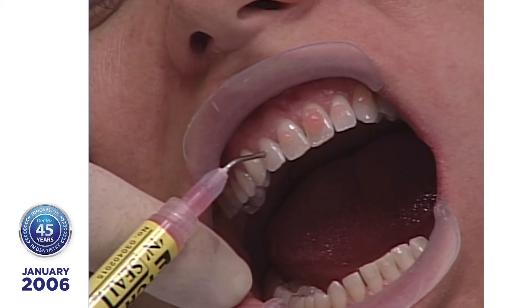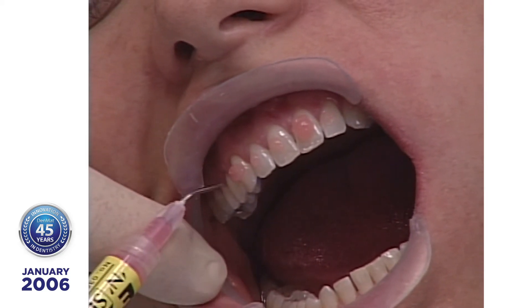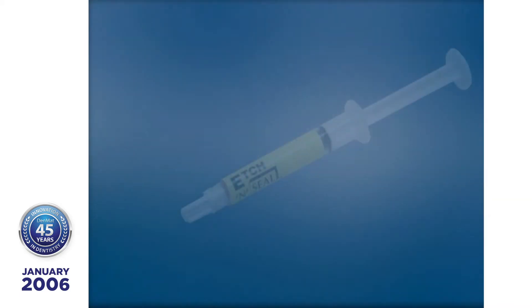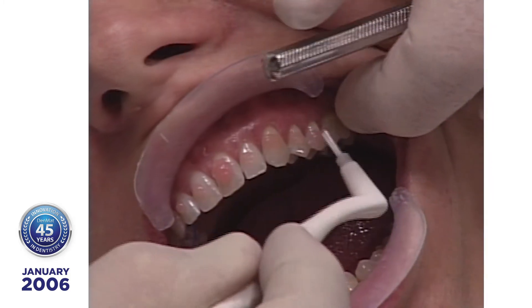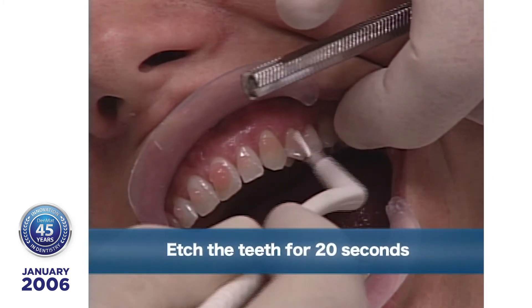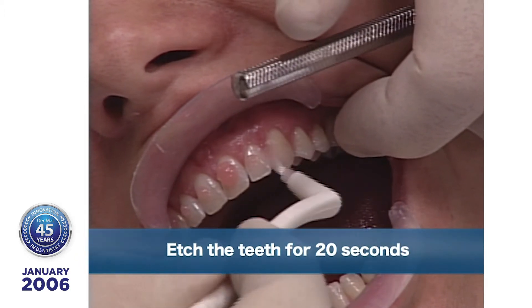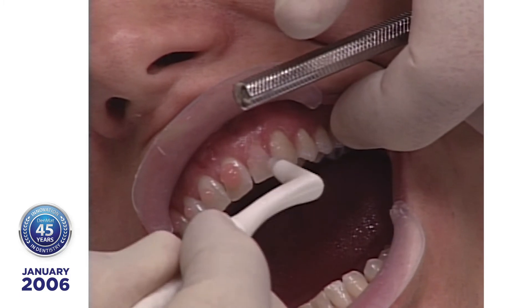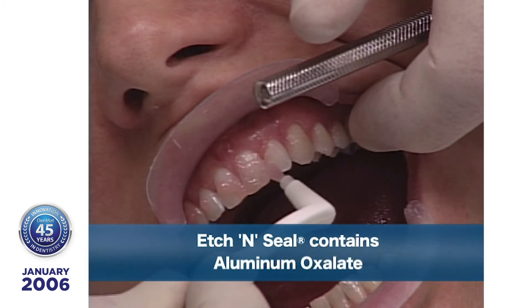The next step is surface preparation of the enamel. I'm using etch and seal, medium viscosity. The reason I like etch and seal is I put a little dab on the teeth — it doesn't run all over — and then I push it. I like to use etch and seal because it contains aluminum oxalate, and that seals the dentinal tubules when you're etching dentin.